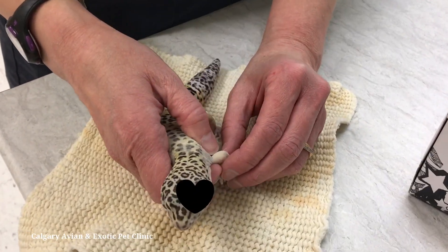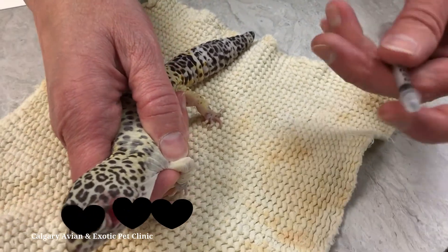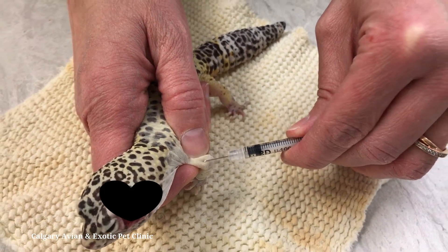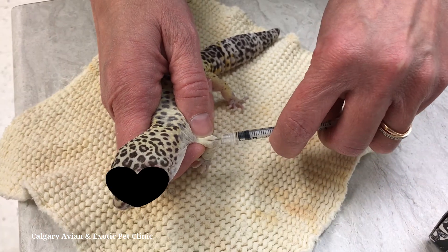After you withdraw the needle, place your finger over the site of insertion for a few seconds to prevent leaking of the medicine. When the next treatment is due, use the opposite front leg and keep alternating sides with each treatment.